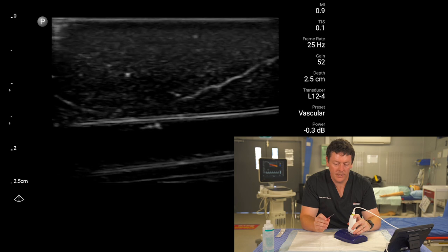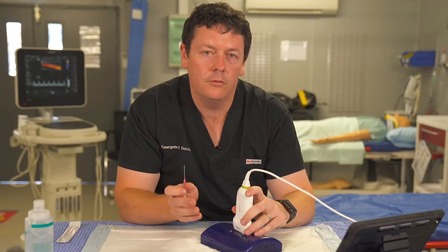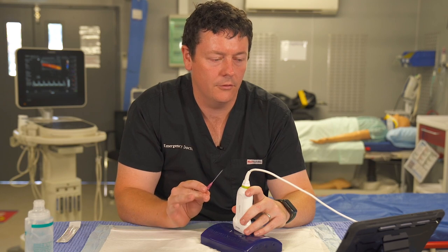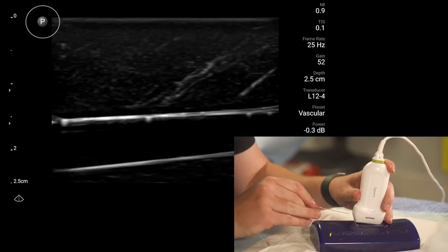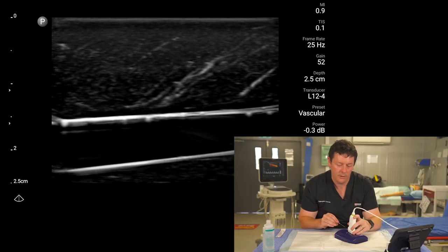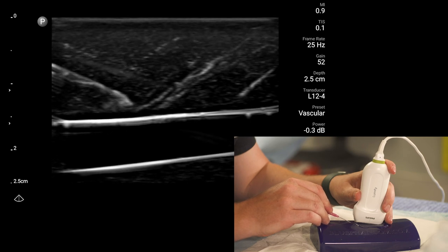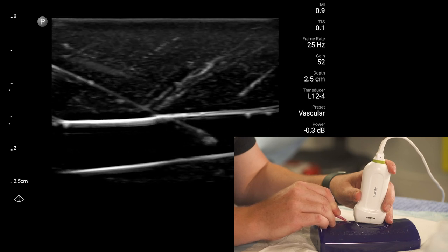For in-plane, make sure your target is right in the middle of the screen. Know where your probe marker is — I have mine facing toward me, which corresponds to the marker on screen, meaning my needle should appear from left to right. Keep the probe as still as possible. After your aseptic technique, quick through the skin — the stingy bit — and you can see the needle coming in nicely. Just follow the needle all the way to your target, keeping it bright on screen.